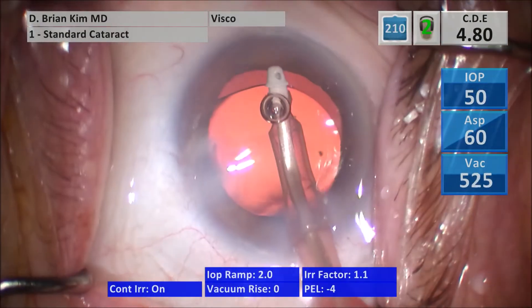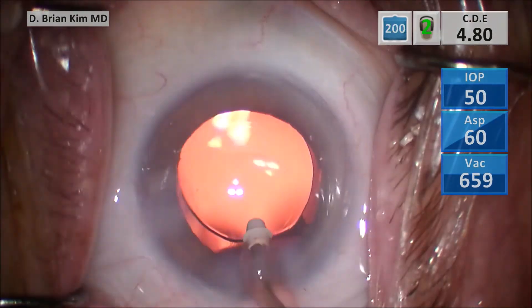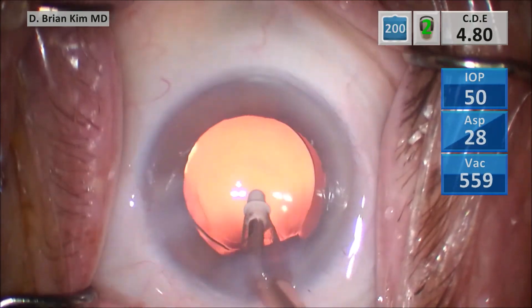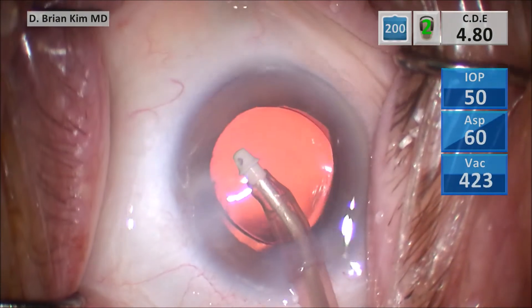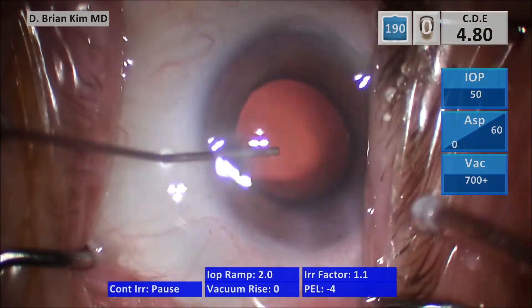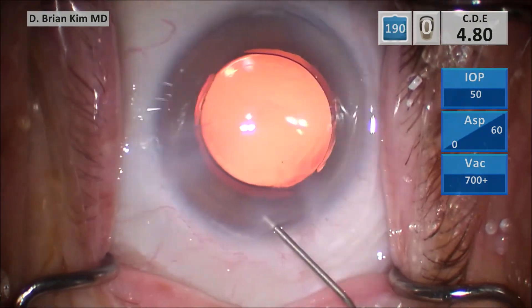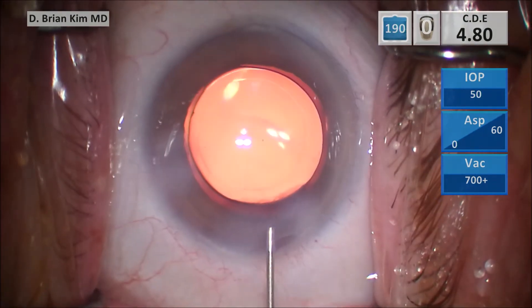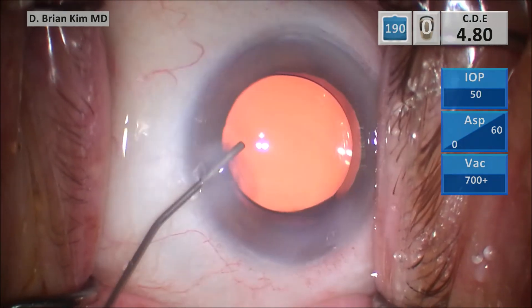Switching to visco mode, and then I'll hydrate my incision. This is a patient with a deep set eye, tight orbit, also a strong Bell's reflex. You saw I was able to perform my standard technique, using the Orlok technique to control the eye and turn it down. You have to use the Orlok technique especially for me as a right-handed surgeon on left eyes — you have to be able to twist that cannula within the incision, which grips the incision. Then I'm able to turn the eye towards the left on the screen in order to make my incisions and continue to do the steps of surgery.